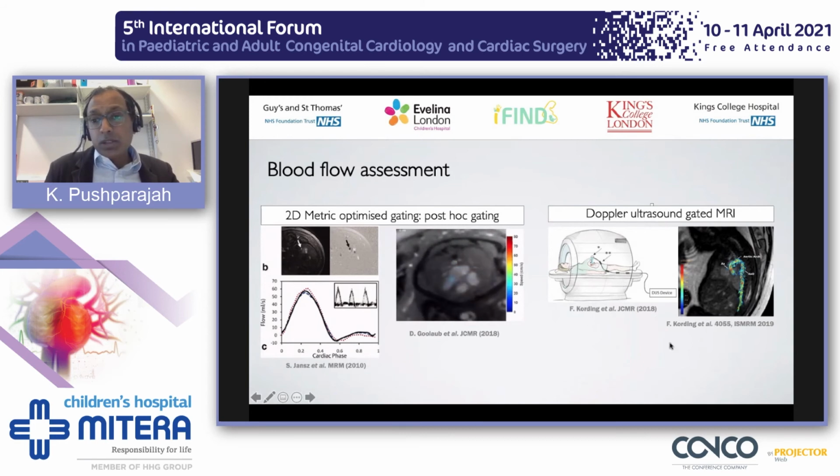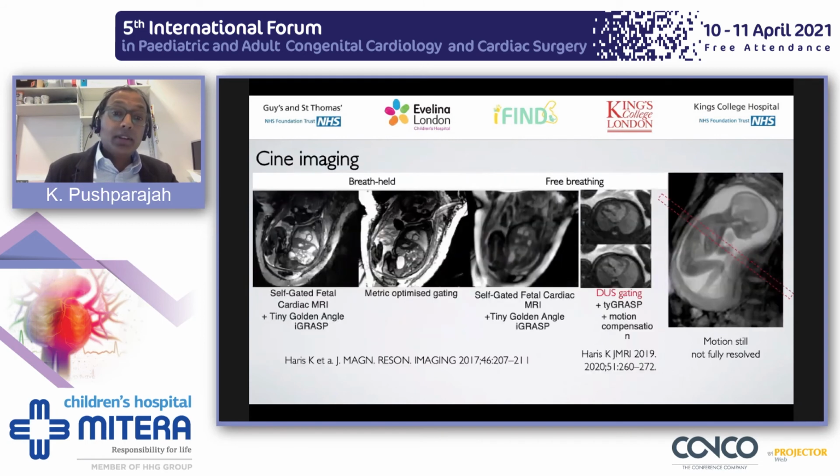Germany, Fabian Kording and the group, they've commercialized a product now which allows you to apply a Doppler ultrasound and extract an R wave that you can then use. So effectively, you just use that and you plug in your normal images. So the group in Hanover are really leading on this. Cine imaging is something everyone's trying to do.